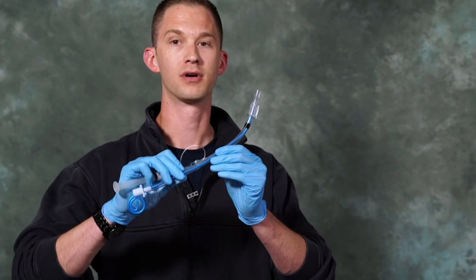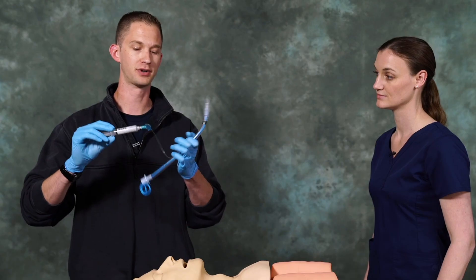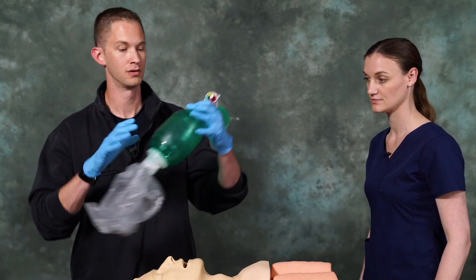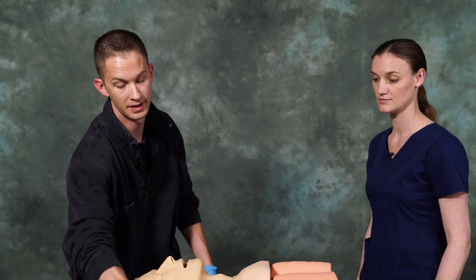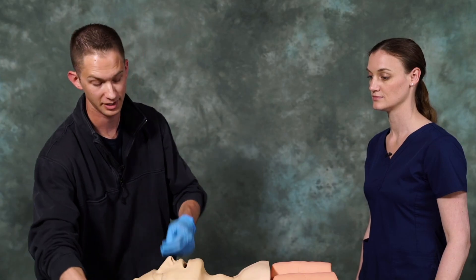We also want to ensure that we have our ET tube with the stylet and a 10cc syringe that's pre-attached to our ET tube. We have our BVM with the mask still attached to it, and then a tube tamer or a roll of tape in order to secure our ET tube once we have it in place.